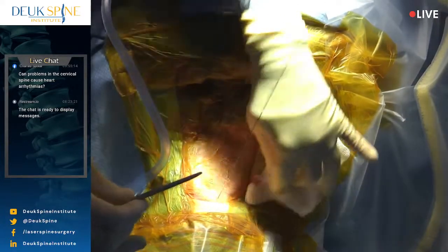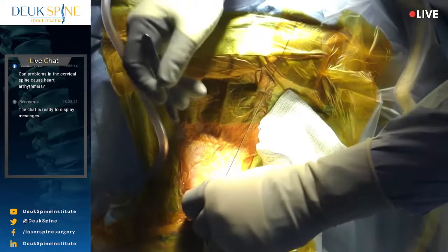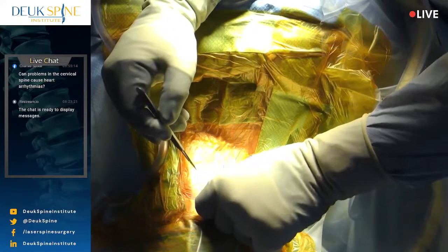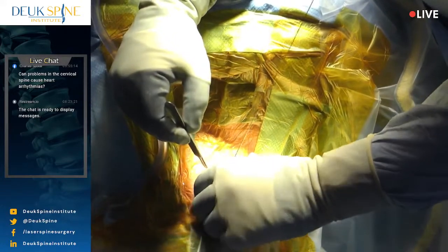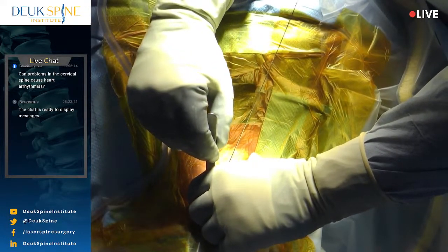Okay, needle's back. I just injected 1 cc of local. It's epi with Marcaine or lidocaine? Lidocaine? Yeah, we don't have the Marcaine, right? Back order. That's what McKesson says? Yeah. All right, shot. Right.